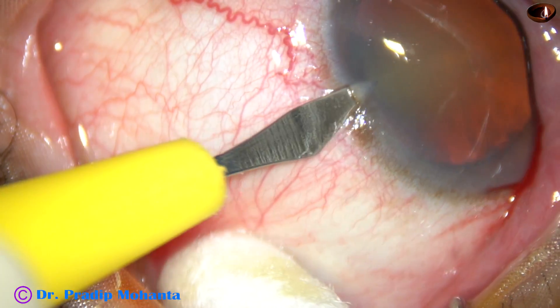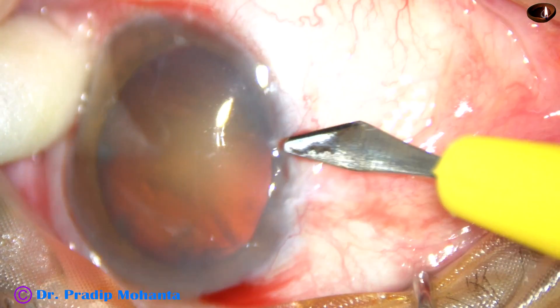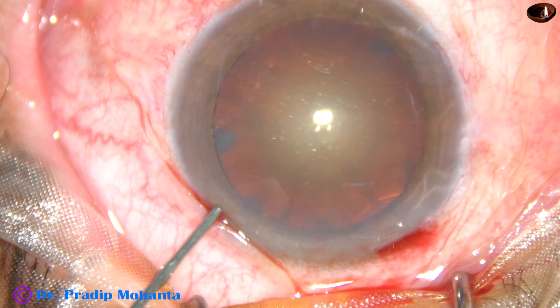And now make the side ports. These are not triplanar. The main incision is triplanar, but the side ports are just a one-plane incision.